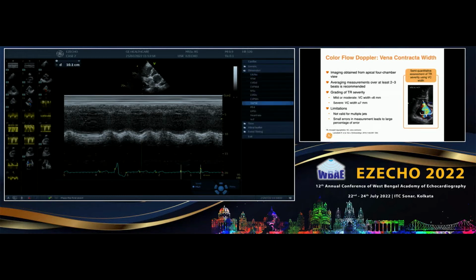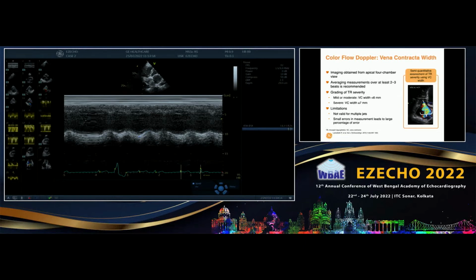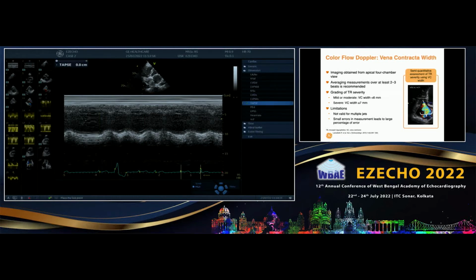Yeah, definitely reduced. So TAPSE is different in spite of the RV dysfunction, the TR is almost 35, 45. It's not actually 17 because your baseline in this is a little bit off. You can zoom it in again. It is this, from 1.5, from this area to this area, from this to this. This is the area and go to this maximum. That's 10. Yes, it will be 10, 12. RV systolic dysfunction is there.